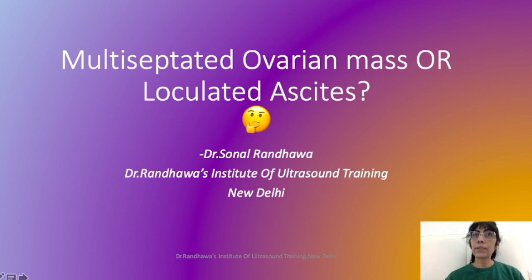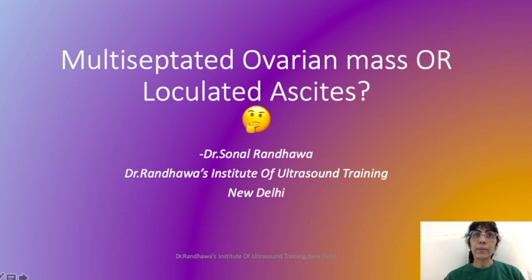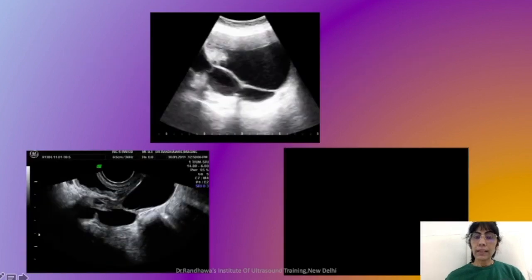Ascites is basically fluid collection in between the organs and areas. So you will find some organ trapped in it, or adhesions attaching to that organ, the septations attaching to that organ, or bowel loops floating within it. You should not make that kind of confusion. Now I'll just show you two or three videos to illustrate what I am trying to say.